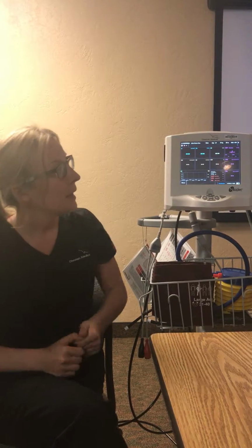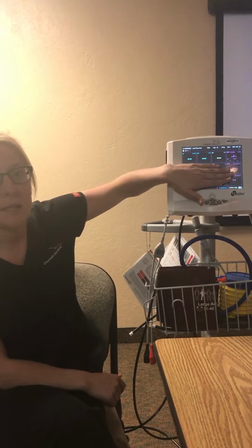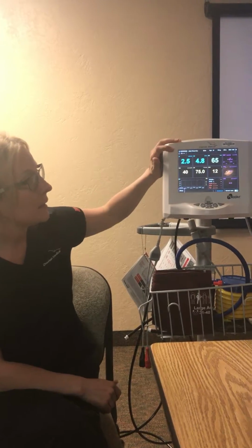If your stroke volume index increases by 10%, which it will calculate for you, you now know your patient's preload responsive. Preload will help with perfusion. It doesn't mean you have to give volume, but now you know that preload volume will help with perfusion if need be. If they are less than 10%, we now know it's not the yellow numbers, it's not preload. So let's look at contractility.